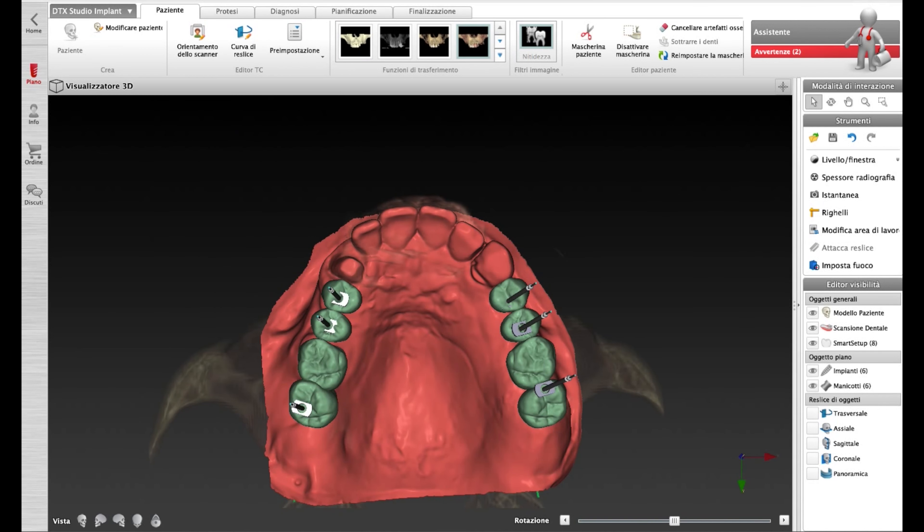Virtual treatment planning with the DTEX Studio implant software by Nobel BioCare company.